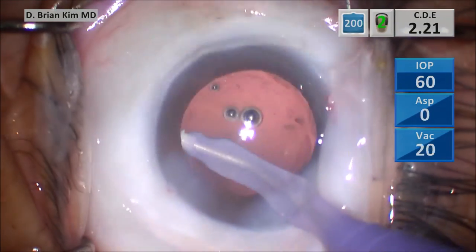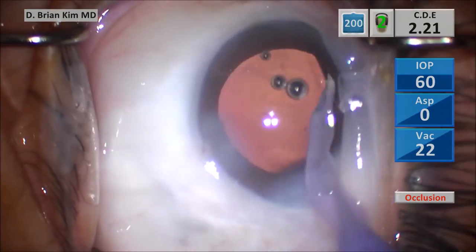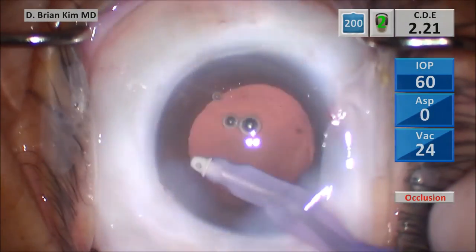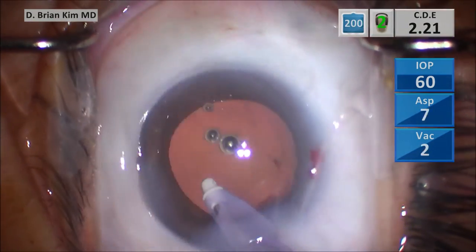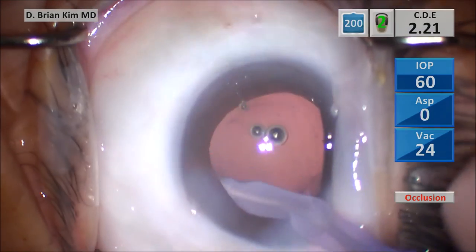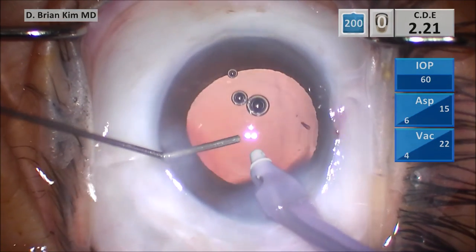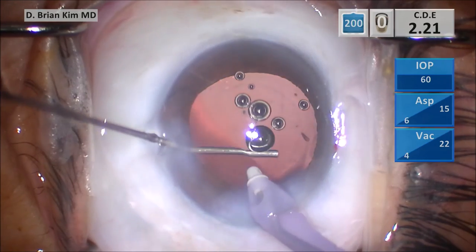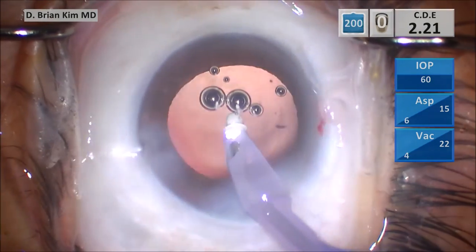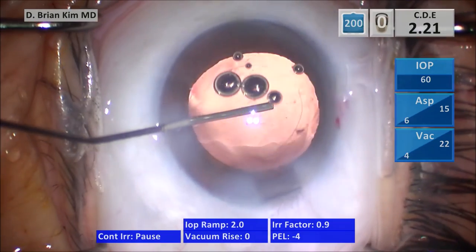Anytime I've noticed surgeons having complications, it's usually because they're getting frustrated with a piece that's stuck in the bag or not coming out as they want, and then they start doing things they're not supposed to — going a little too deep with the phaco tip, using ultrasonic energy or vacuum that's too high within the bag, and then a complication occurs. If you're able to mechanically crush the lens pieces between the chopper and the phaco tip, manipulate lens pieces out of the bag with the chopper, feeling comfortable within the capsular fornix, prolapsing lens pieces out of the bag, and using the chopper and phaco tip to crush — this is a very powerful technique. I have really moved forward and not gone back to any other techniques.